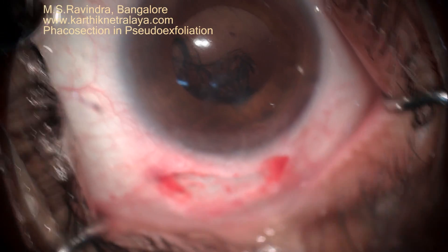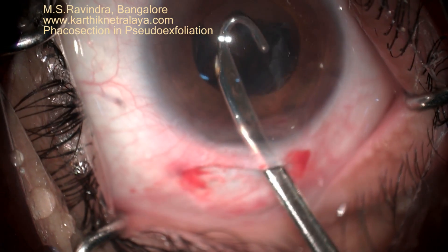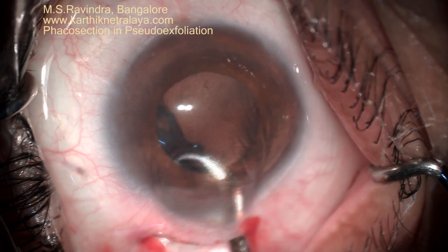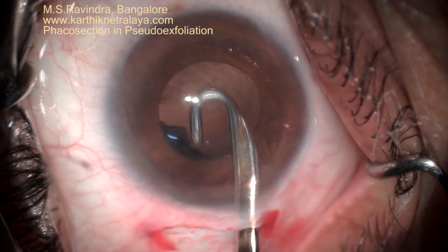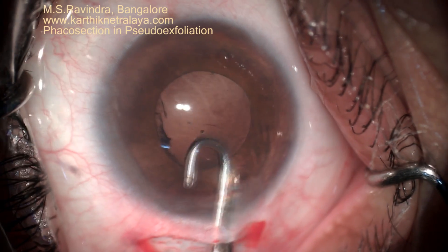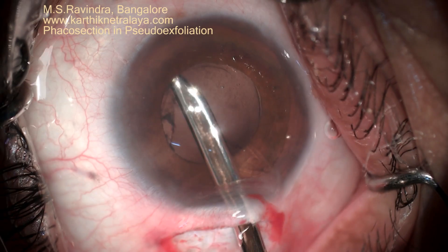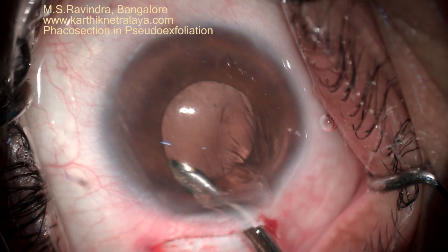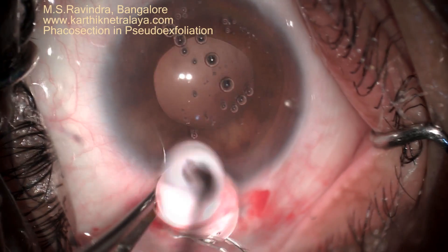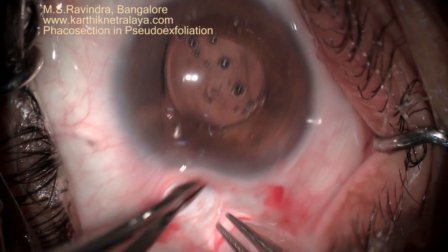This is good even for subluxated zonules and subluxated cataracts. There is no need to put the endocapsular ring, as you are not pressurizing the anterior chamber and you are not manipulating the nucleus within the capsular bag. The entire cortical aspiration is done using right and left Simcoe cannulas along with the help of the straight cannula. There is only one tunnel and the lens is placed, ensuring that it is placed inside the capsular bag.